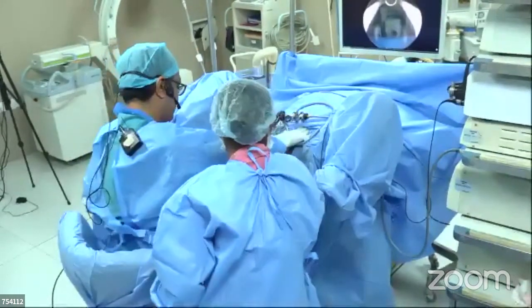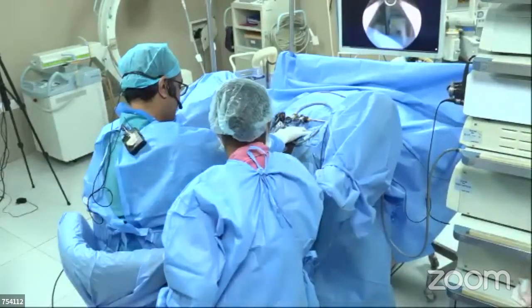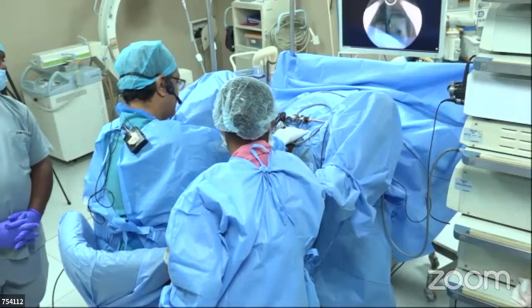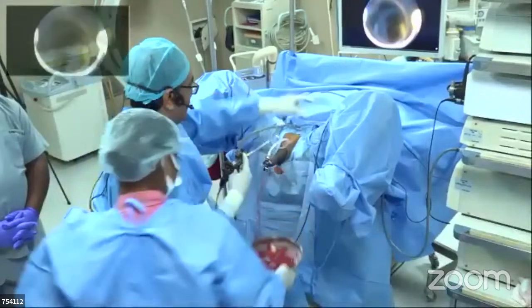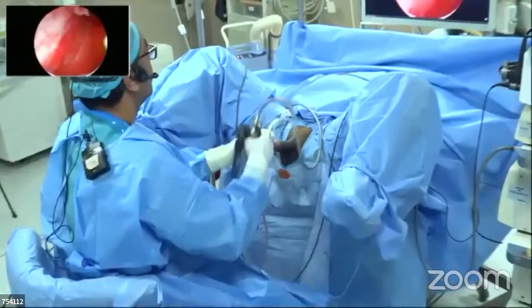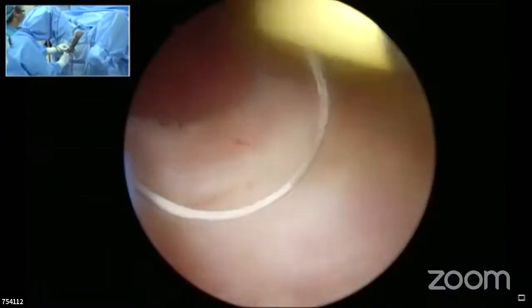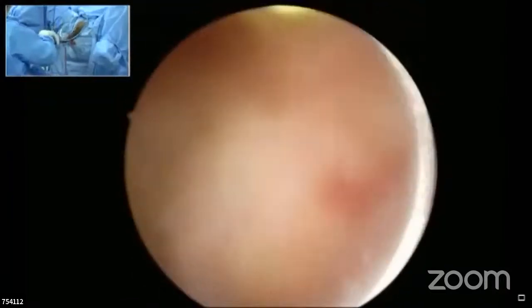Is he using a finger active or a thumb active? He uses an active working element. You see that it is coming out of the sheath. He uses a finger active one. I am an active finger man. I always use active now. Yeah, I am an active finger. We have both actually. In my hand it doesn't make any difference. I don't even check actually what I get in my hand. But normally I prefer to have an active one.